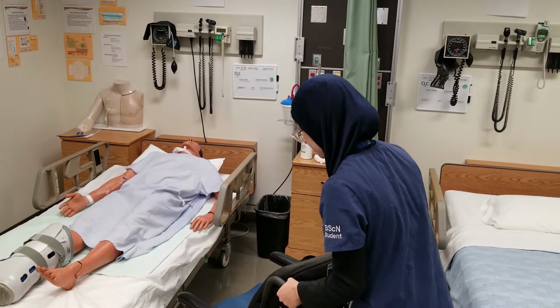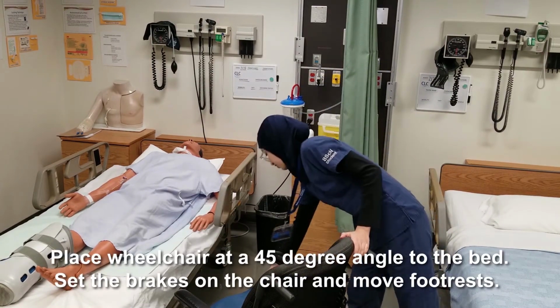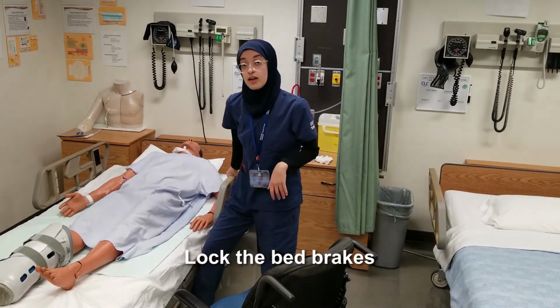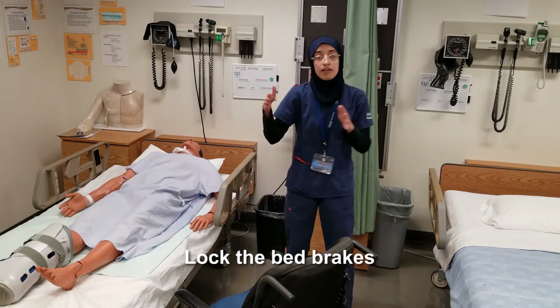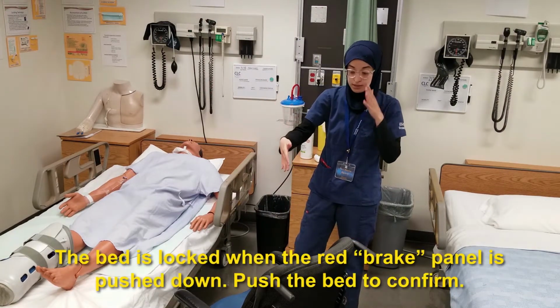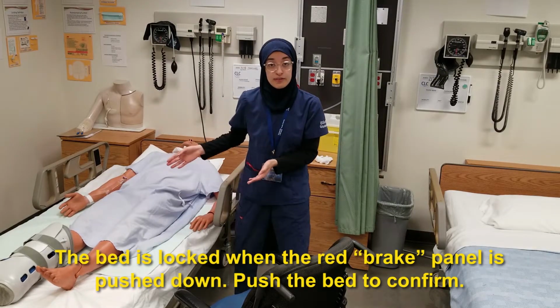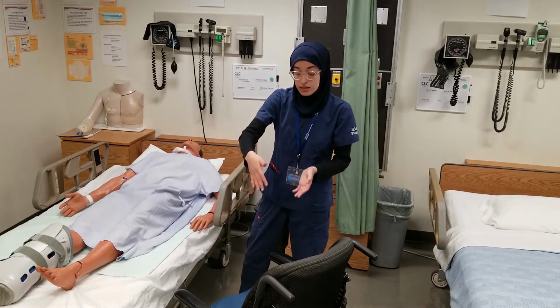I'm going to position it. Make sure the brakes are locked and the footrests are either way. I also want to make sure that my bed itself is locked. So if I came into the room and it was very narrow and there was enough room for me to move my wheelchair, I might turn off the brakes and move my bed, maybe at a 45-degree angle, to allow me space to put the wheelchair.